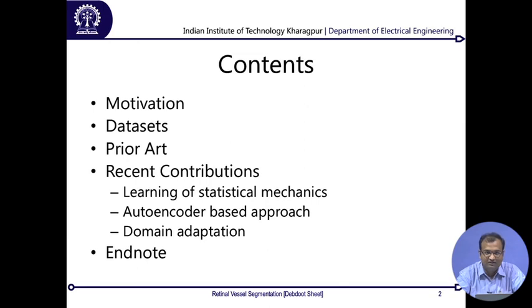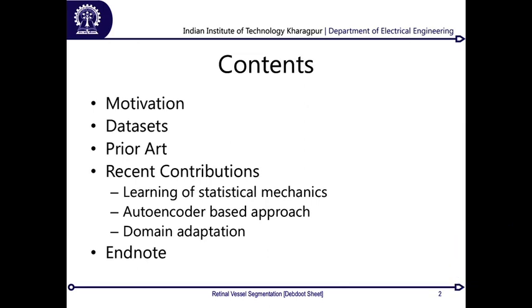One of them is by understanding the imaging physics itself, and then putting some sort of a machine learning algorithm on top of it, taking cues from imaging physics to do image analysis. The next one is a pure data driven approach, which makes use of deep neural networks to do image analysis from the perspective of vessel segmentation of retinal vessels.